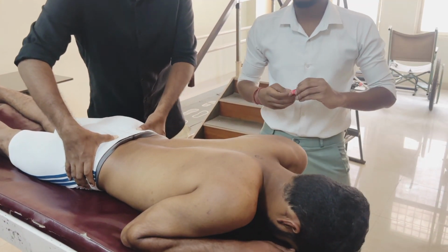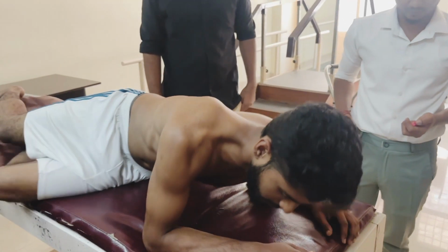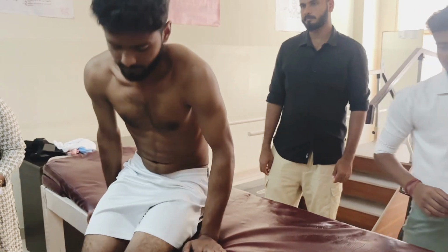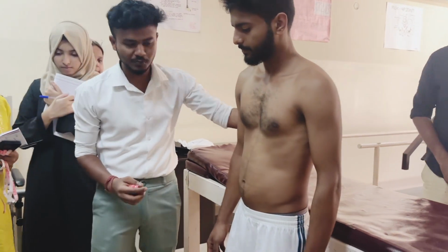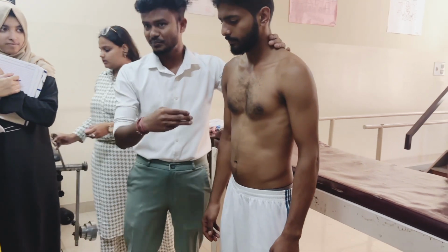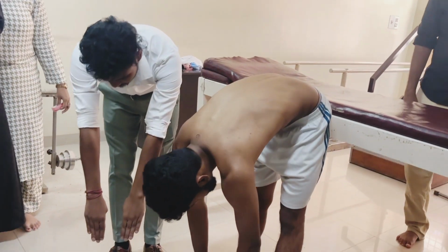Now we will see flexion. Okay, stand. So now we will see how to measure flexion. The patient already knows what flexion is. We will ask the patient to go for flexion. Keep your knees like this.